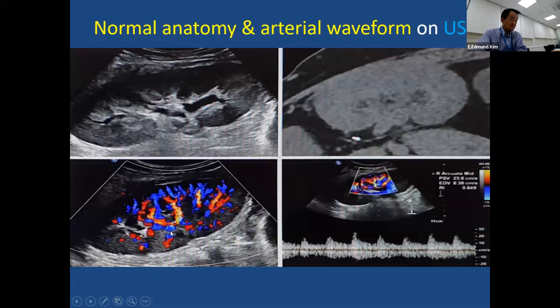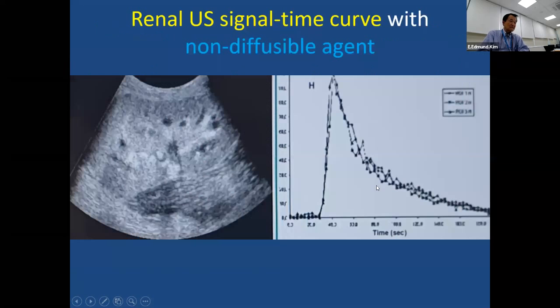And with the ultrasound Doppler study of the vascular structure, they measure the resistance of the arcuate and some renal arterial branches. And by using a certain contrast agent, just like a nuclear medicine study, they can make a time activity curve, not activity time, a signal echogenicity curve, and make this kind of renogram type curve.